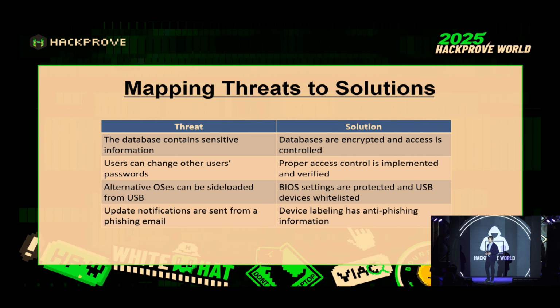Typically, when going through a threat modeling exercise, we're going to build out this huge list of threats. So, step-by-step flow, we'll get a bunch of information about a device. We'll get the device itself. We'll just take a look at it. We won't start doing any hacking or anything yet. And then we just think about everything that can go wrong, and we write down our solutions there.